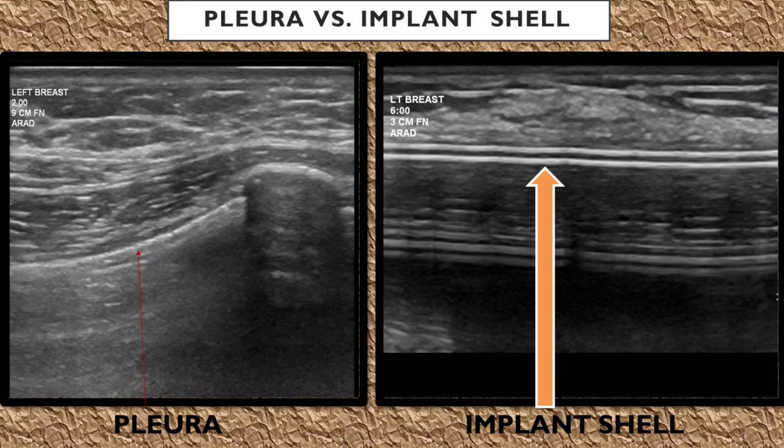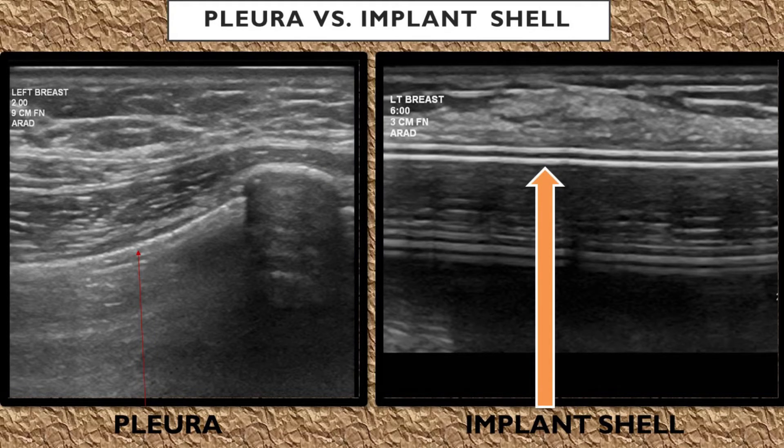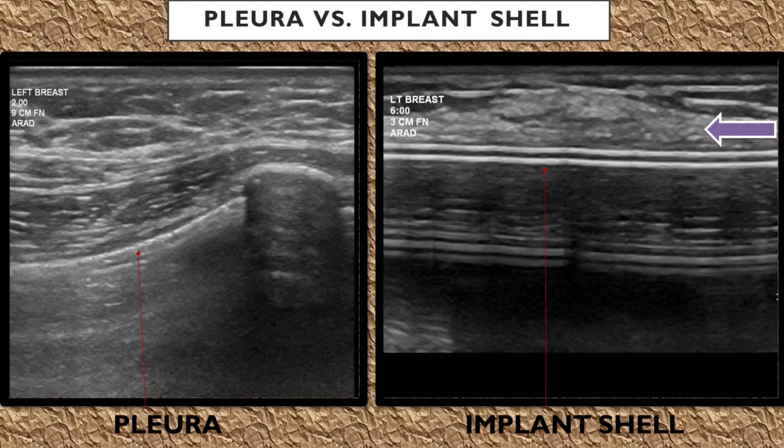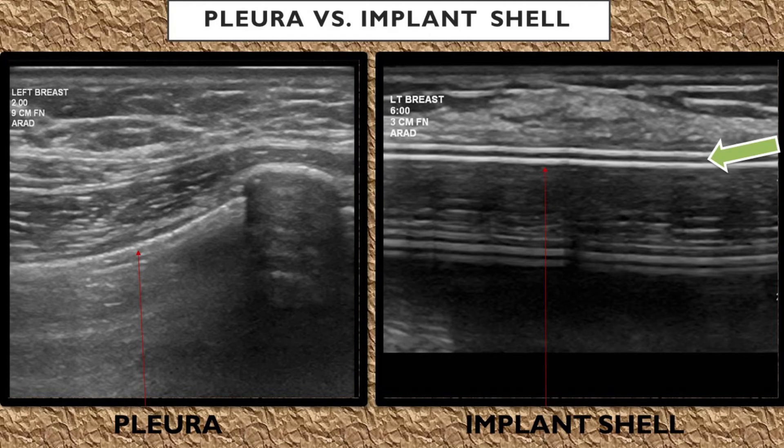However, the implant shell looks different than the pleura because it's more echogenic, and you're also going to see either the double line sign or the triple line sign. This means you may or may not visualize the fibrous capsule, as it can blend in with the tissues, but you're always going to see either one or two lines of implant shell. There's always going to be a dark anechoic lucency between the two layers of the implant shell wall if it's a type of implant that has a triple line sign.